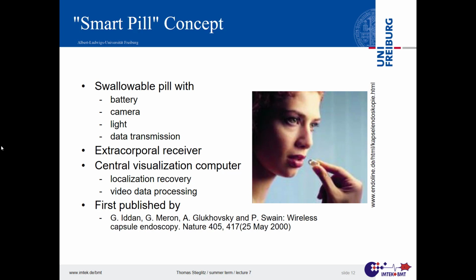Yeah, just as a side story of science, you sometimes really need a vision and a long timeline to succeed with that. The idea is you swallow a pill, and that pill takes pictures. That means it needs a battery, since it's not a good idea to swallow a pill with cables. Right? So I've seen many research approaches where there's something wrong. Either people have no energy supply and they tell you what they can do without any cable, any battery, and then you have to find out by yourself, oh, that was just the proof of concept without the electronics, or there is sometimes electronics in there, but no energy supply, and then there are hidden cables somewhere. Here, to make it feasible, energy storage with batteries.